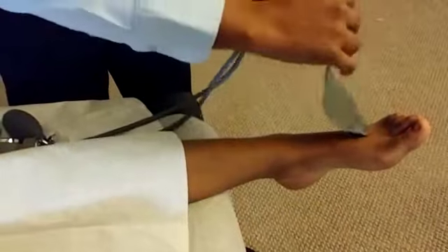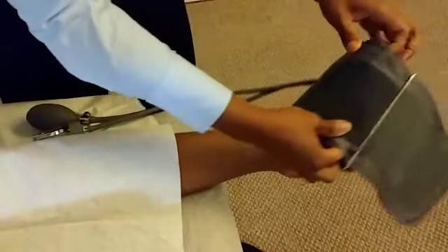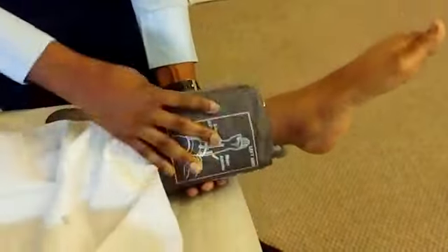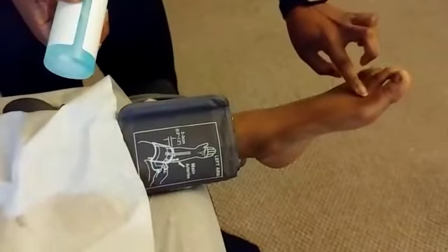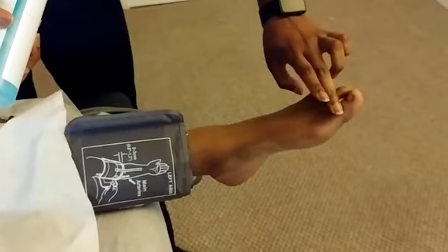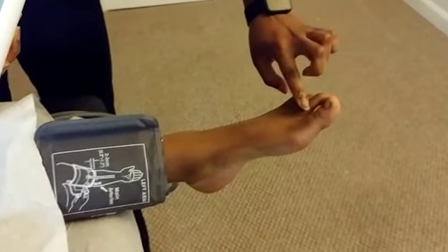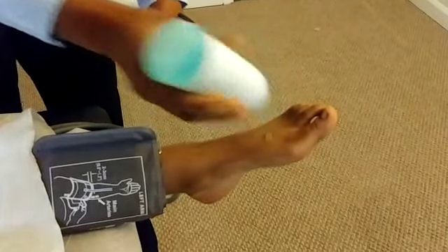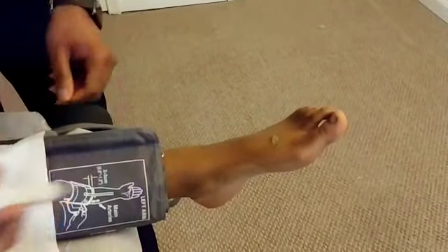I'm going to repeat the same thing on her left ankle. I'm going to wrap it nice and snug, not too tight. I'm going to start with the dorsalis pedis. Usually you want to look at the big toe and the index, and you want to slowly follow that down, and usually you should run into your dorsalis pedis artery.